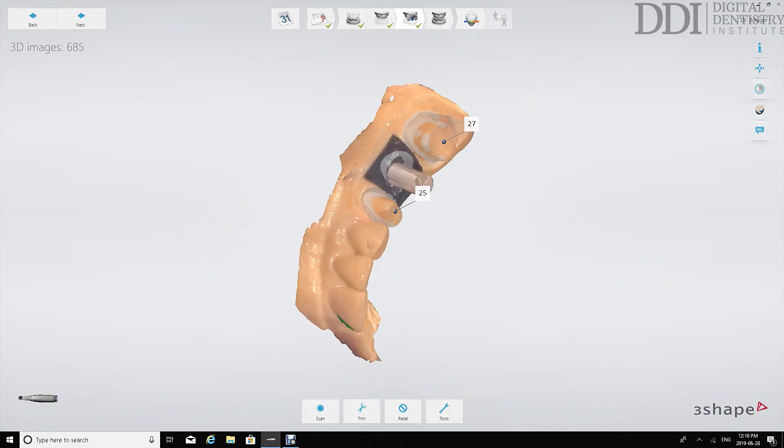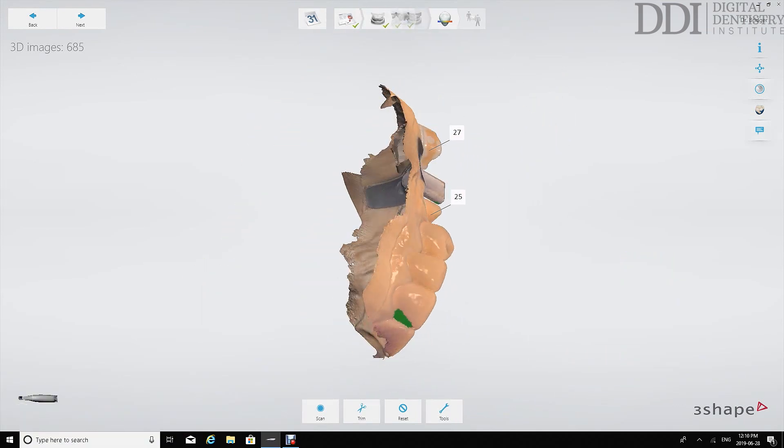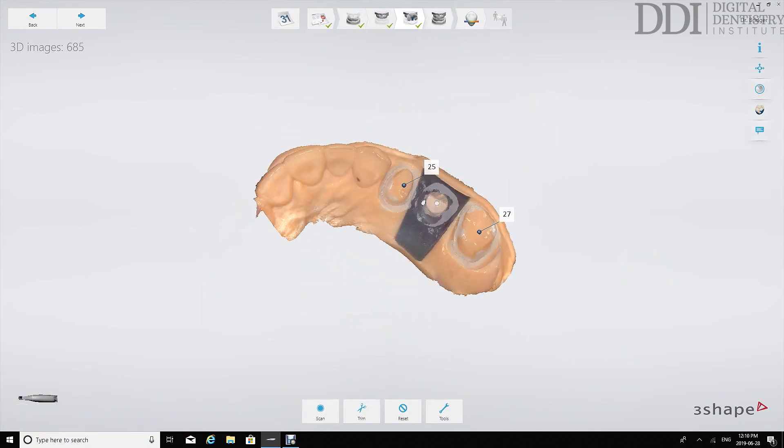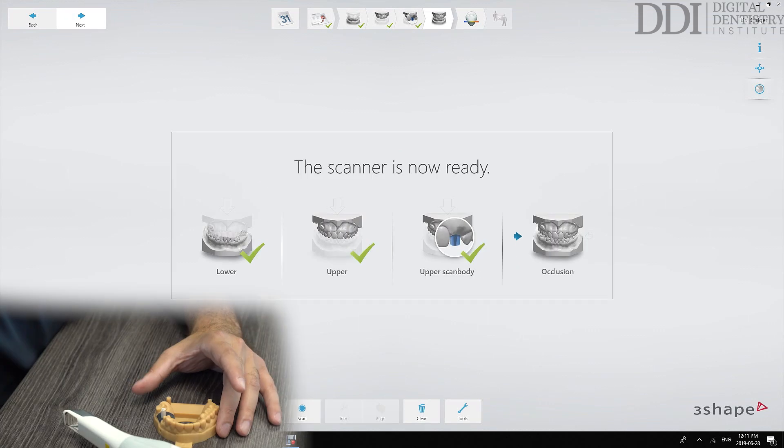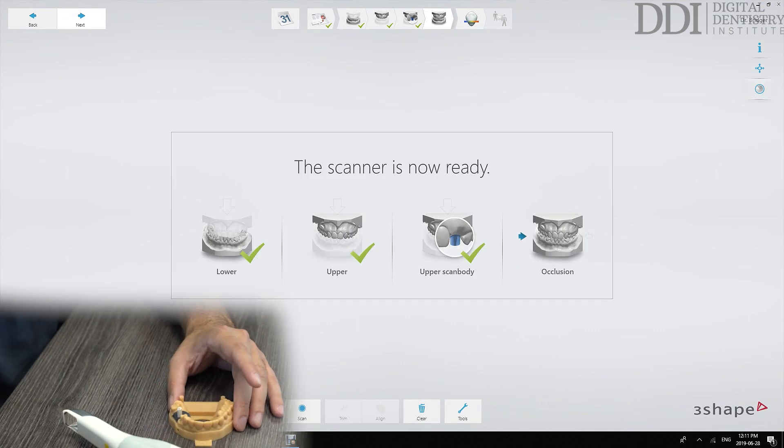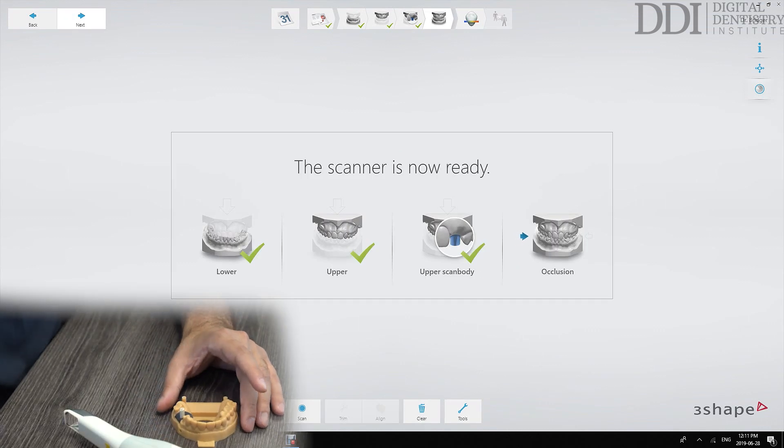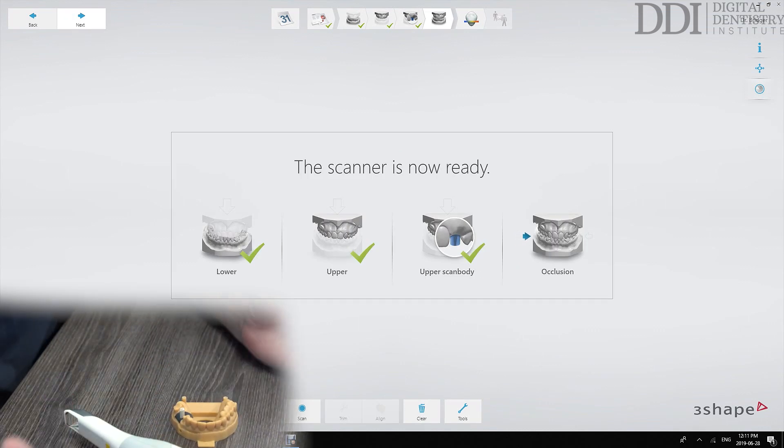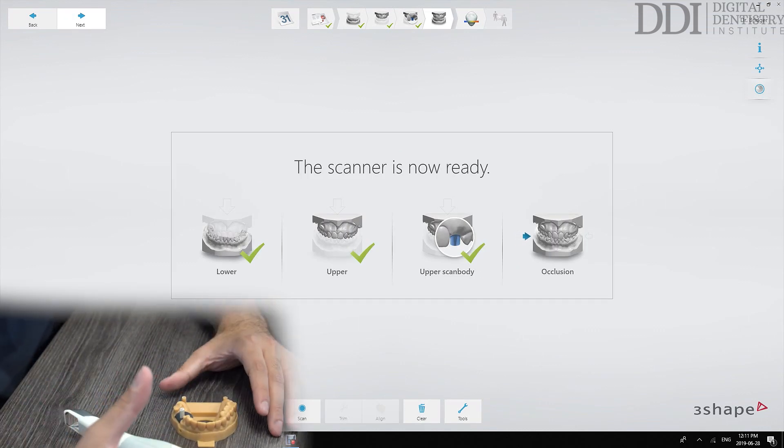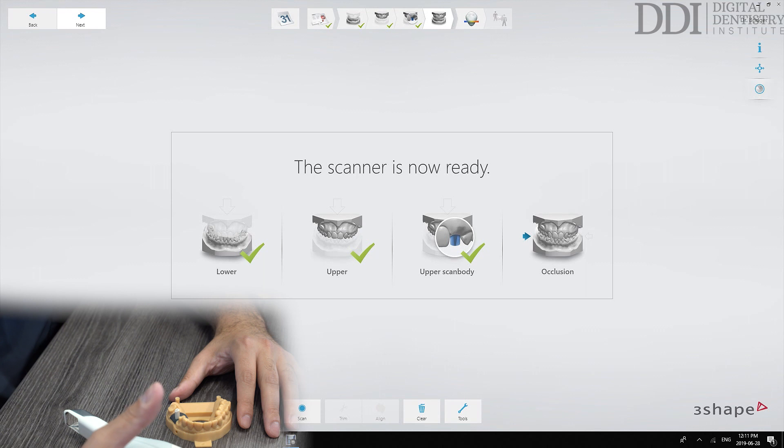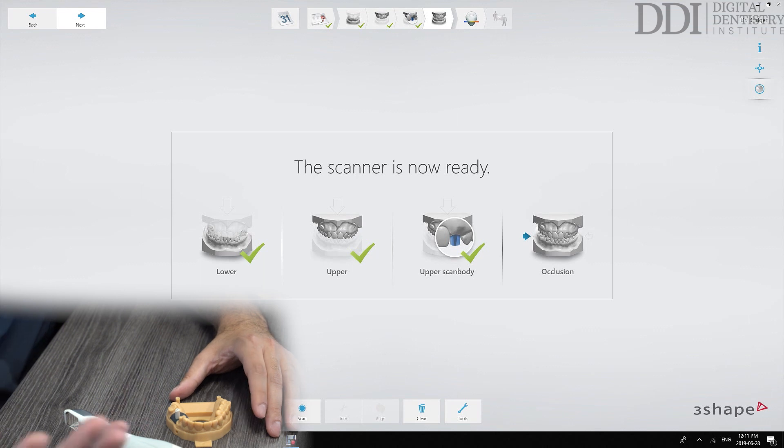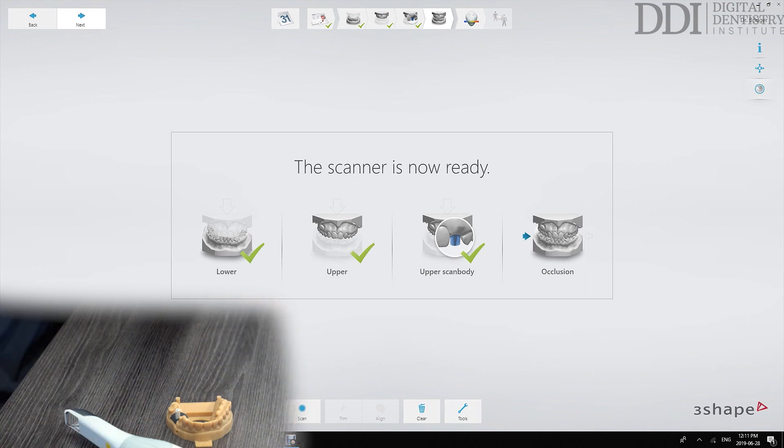So what we'll see at this stage is we've captured the scan body. Last but not least what we want to do now is capture an accurate jaw relationship record which will bring the upper and lower scans together in the correct bite.